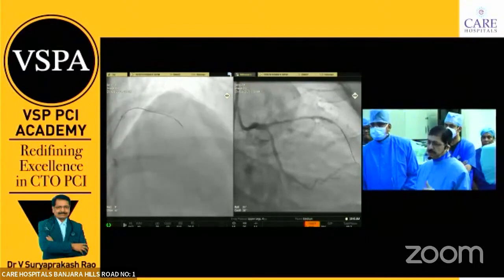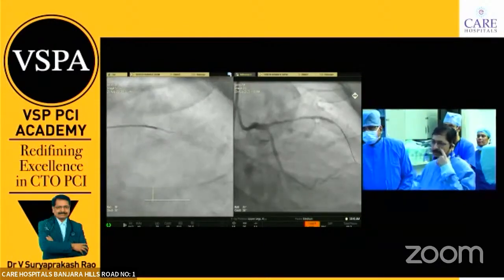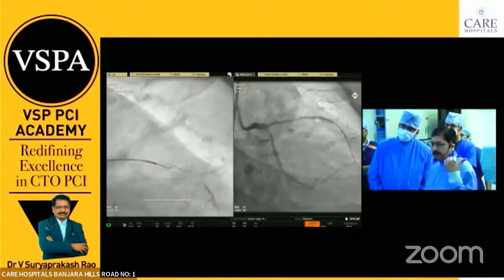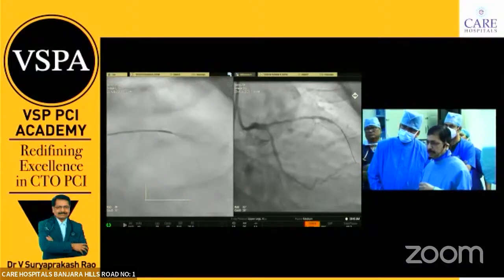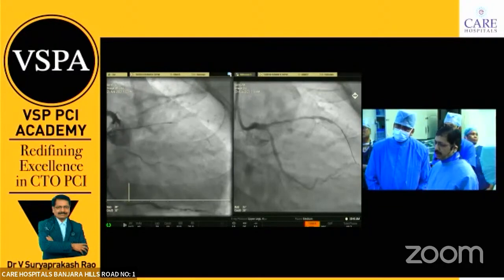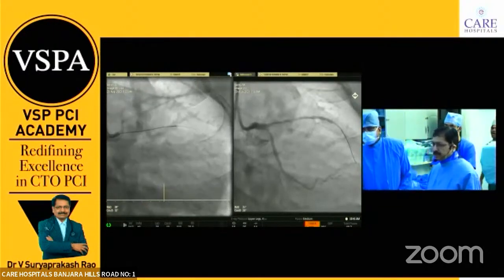So I went to a caudal view again and checked whether my position is correct or not. You see, that's very important. You see the caudal view. Then I pull my microcatheter back when it is not in the true lumen here, then redirected the wire. Yes, a polymer jacket wire is not the correct wire to redirect, unlike Gaia, but a little tip modification you can do that.